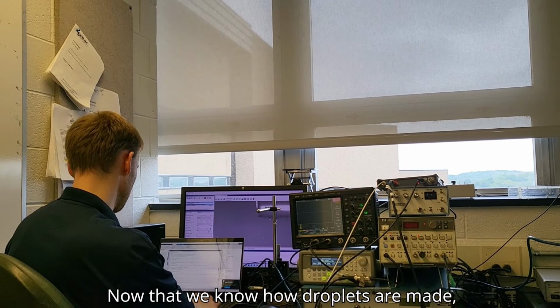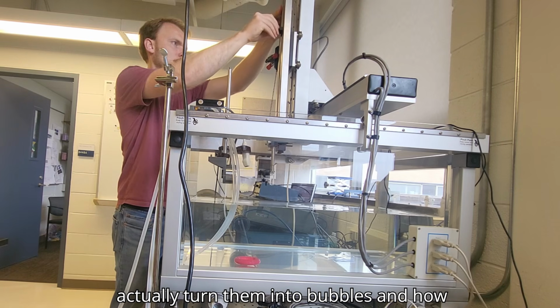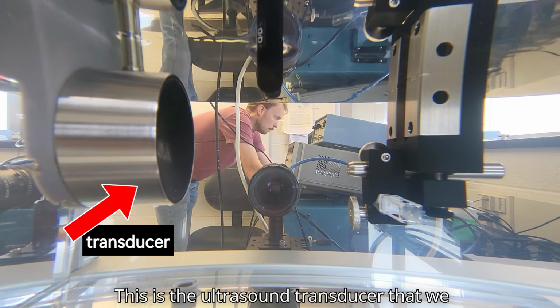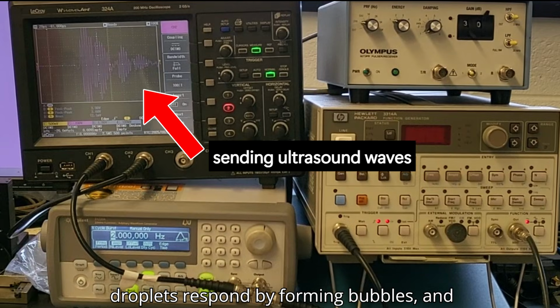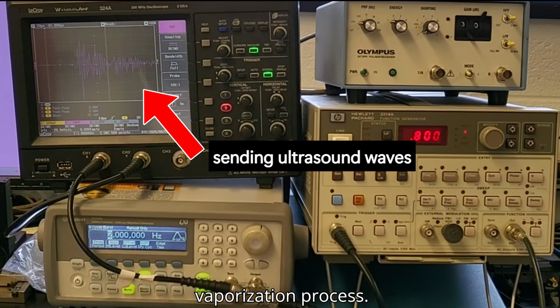Now that we know how droplets are made, let's expand a little bit more on how we actually turn them into bubbles and how we study these bubbles in the lab. So this is the ultrasound transducer that we use to send ultrasound waves. When these ultrasound waves hit, the droplets respond by forming bubbles. And this is what we call the acoustic droplet vaporization process.